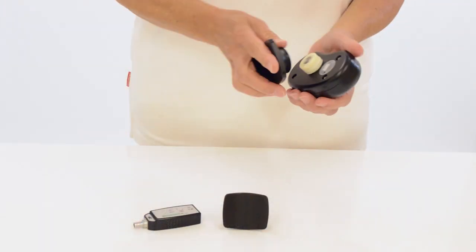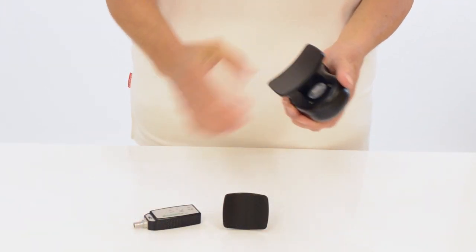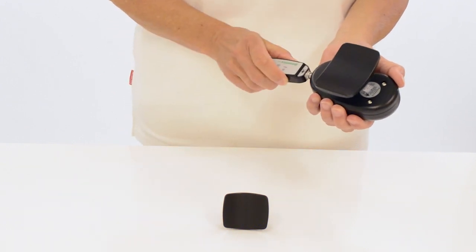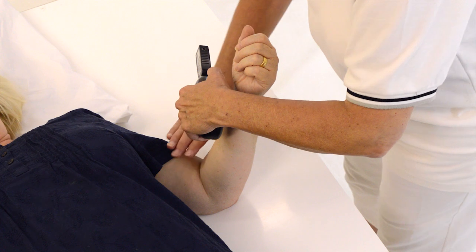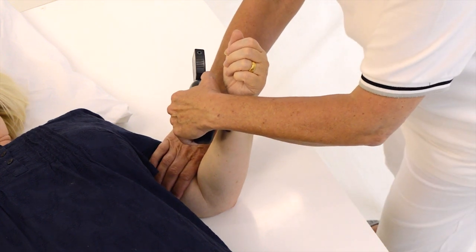The e-link myometer comfortably fits in the hand and the curved anvil is simply placed against the body part to be tested, distal from the axis of movement. The body part is stabilized and held in the desired starting position.